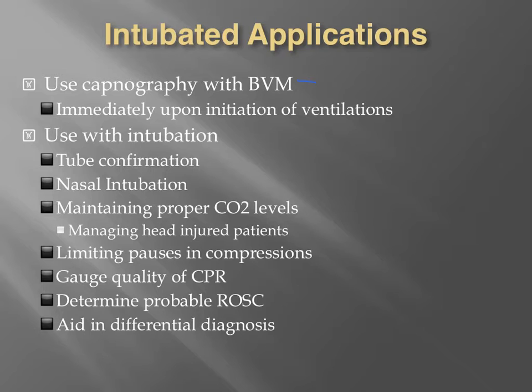On a bag valve mask we have the connection here, and right on here is where we would place our end tidal going to the monitor. And then over here we have our bag valve mask. I know it's a beautiful drawing, I'm an artist.